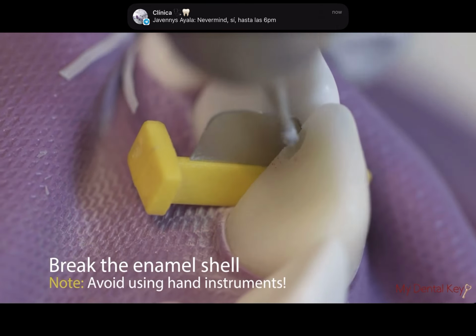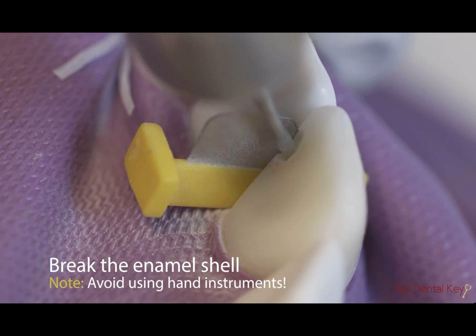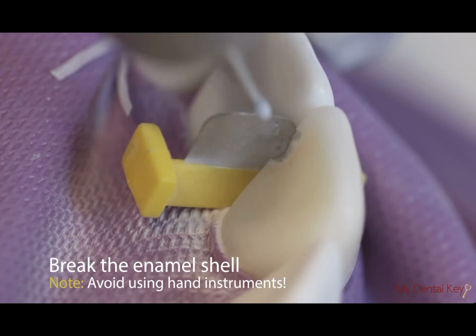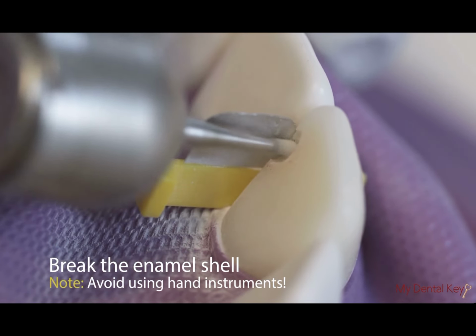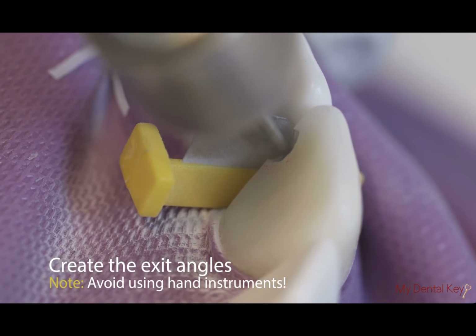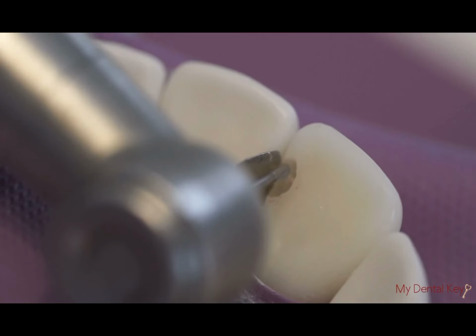If you had left an enamel shell, you may now break the enamel shell, but avoid using hand instruments as they may cause the tooth to fracture. Here, you will see the 330 burr being used to break the enamel shell, create proper exit angles of 90 degrees, and remove all unsupported enamel.